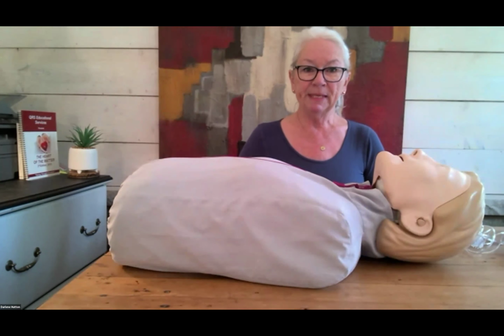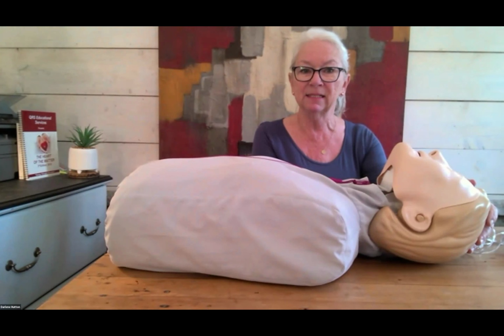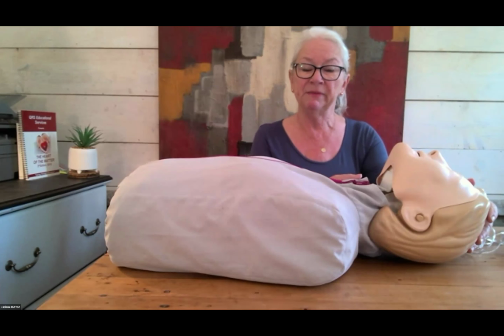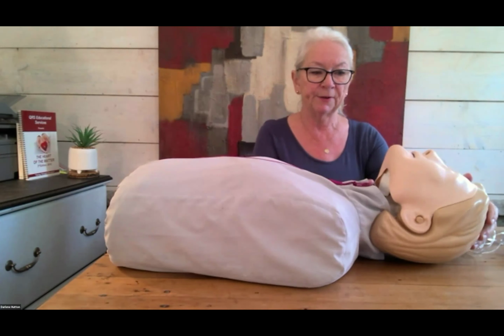In terms of position, it's really nice to have that head tilt chin lift to visualize the vocal cords. And so you may want to prepare ahead of time, get a towel or pillow to put under the nape of the neck if required.